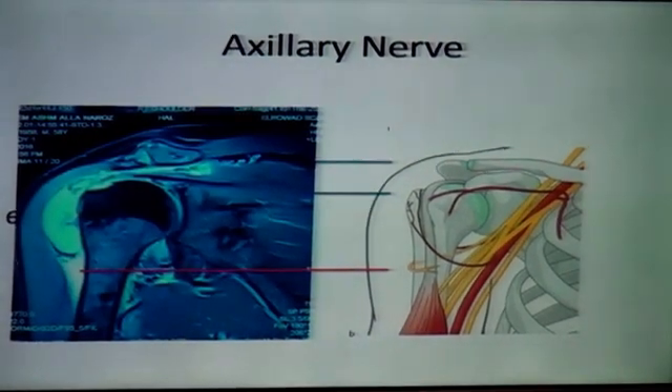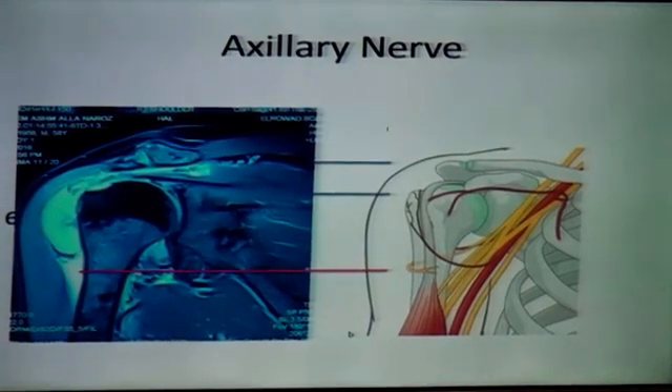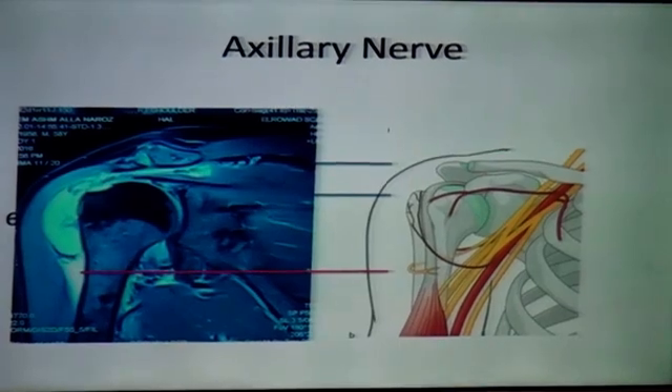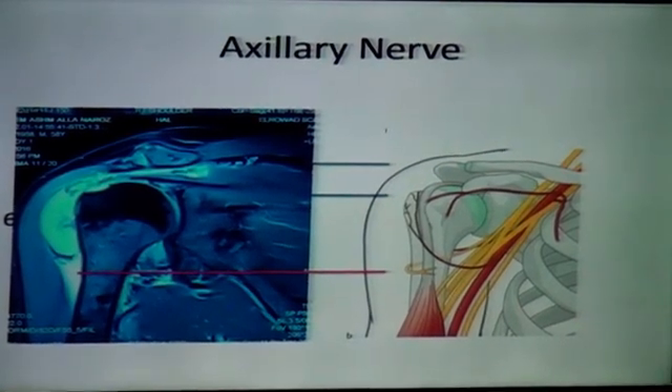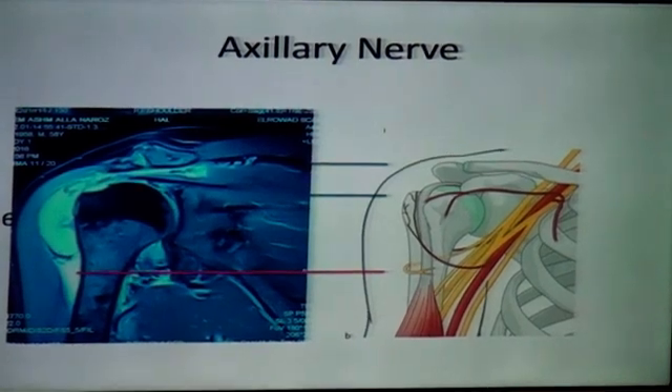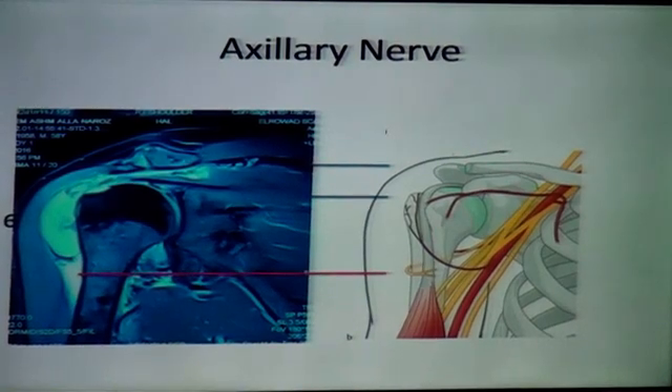I just want to show this MRI, which is for some other pathology, to illustrate a very important note: try to feel the axillary nerve. When you open the proximal part, you will put your finger in and feel the reflection of the sub-acromial space. This is your safe zone. The axillary nerve is immediately under this space, so if this reflection is intact, you are safe — the nerve is just under that.